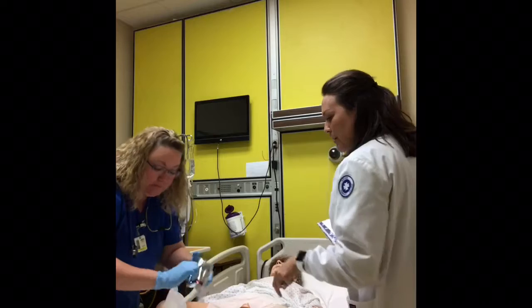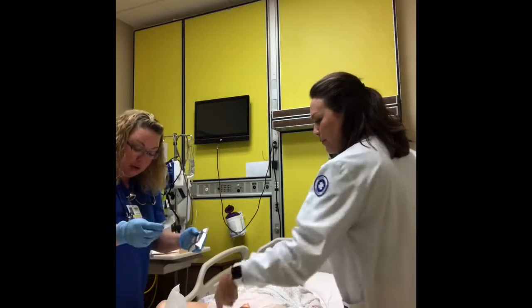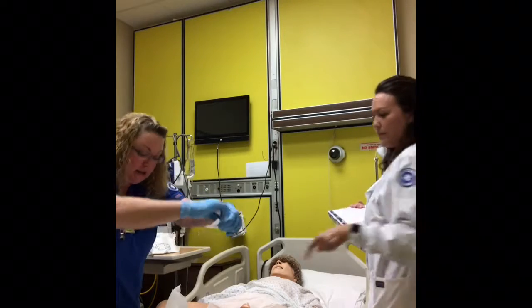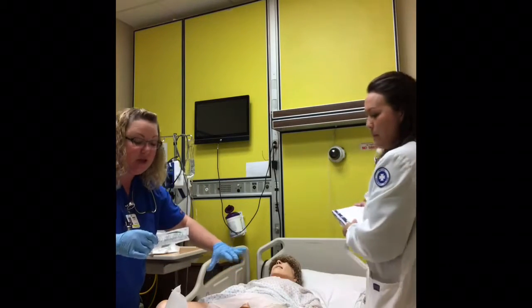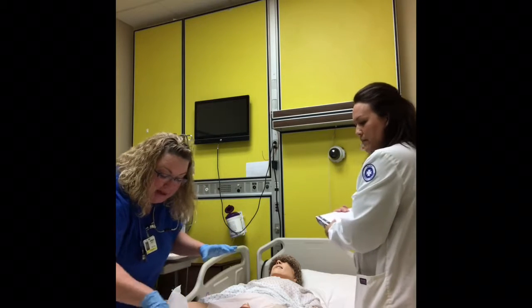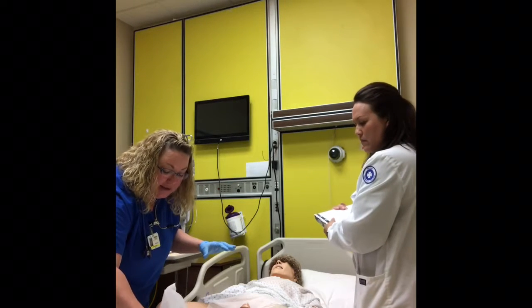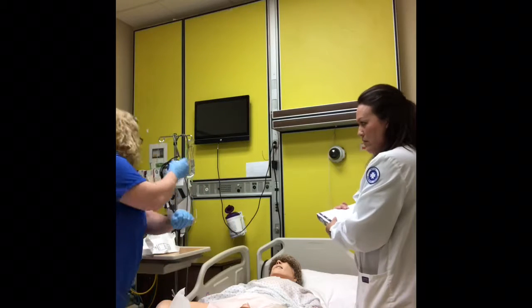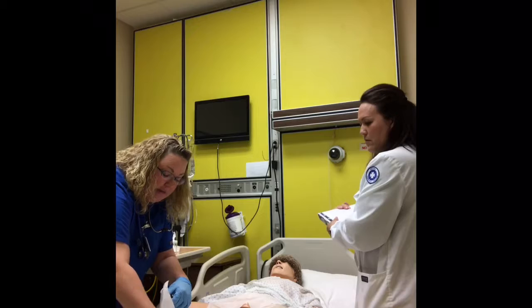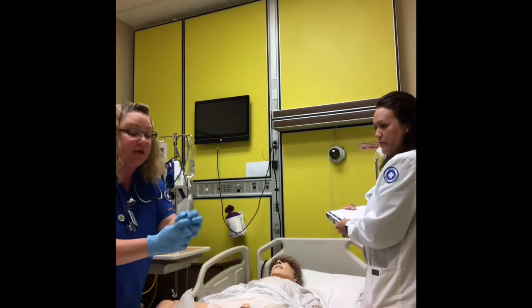So open the lube. We're going to get our lube and squirt it in here. And then we're going to open up our iodine packet like that. Now once I touch the patient, this hand is dirty, so everything else has to be ready. So I've got my iodine packets ready to go. I'm going to take this out and make sure I don't touch anything or turn my back on my sterile field. Then I've also got my water, which I'm going to connect now.